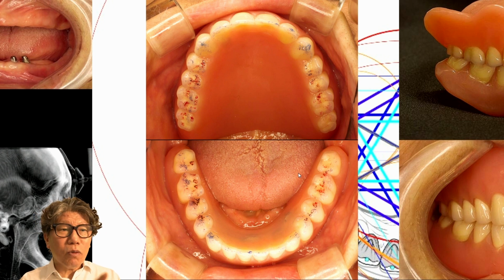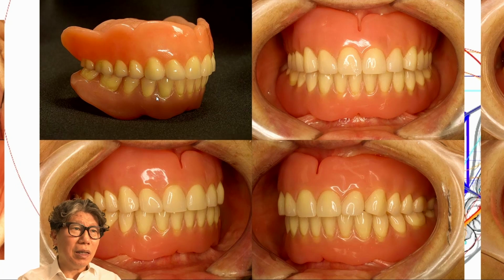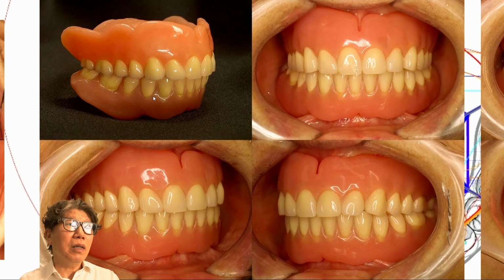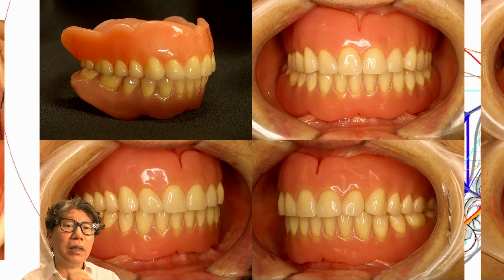So the focus is not on the implant over denture, but whether a fully balanced occlusion can be created. Next, the maximum occlusal pressure of the dentures should be holding the upper and lower dentures in place. Therefore, it needs to be stabilized. It only works if stabilizing is achieved. If the centric relation occlusion is not aligned in 3 dimensions, then these dentures will slip. Then the mouth cannot be controlled.